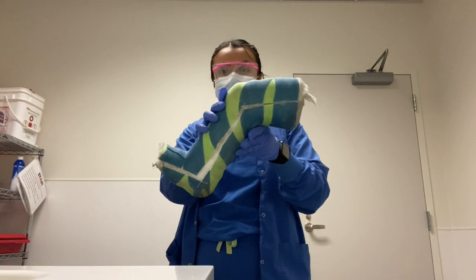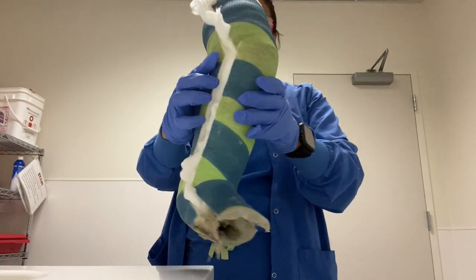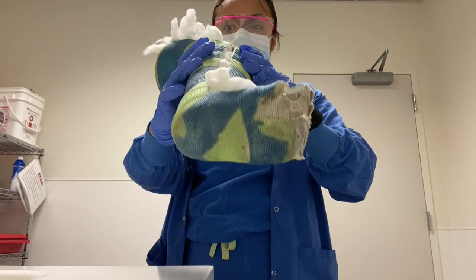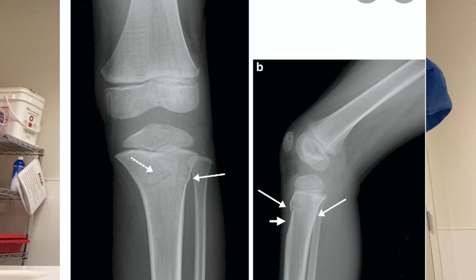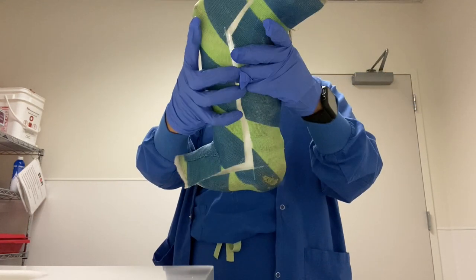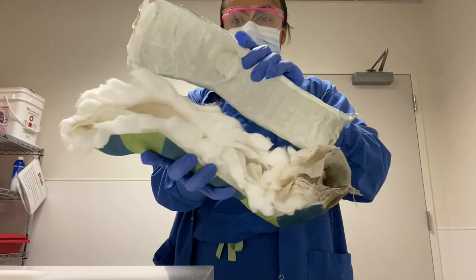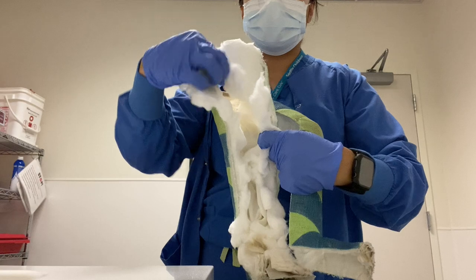Our first kiddo of the day is this cast removal — it is a long leg cast, and this kid got lucky: they had two colors on their cast. This kid had a proximal tibia fracture, but thankfully we were able to remove it. Once we removed the cast, the patient couldn't go into a boot because the boot doesn't cover all the way up to where the fracture site was, so they were free and able to walk once they were ready.